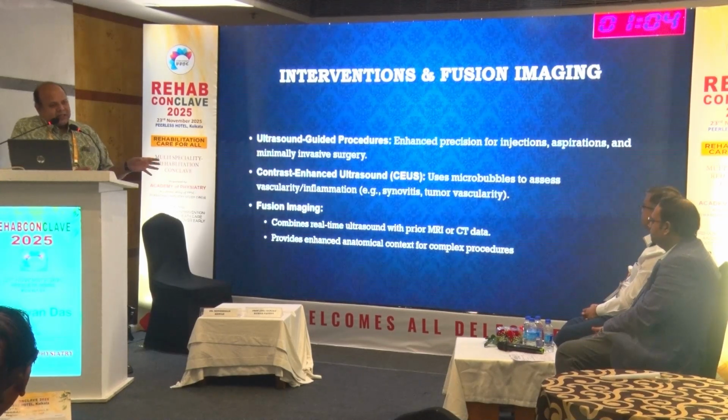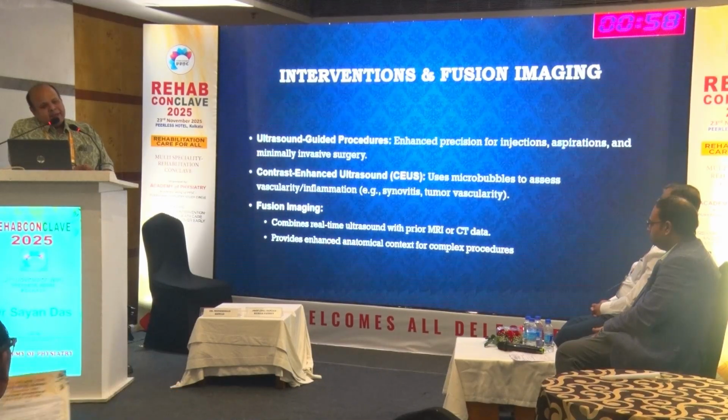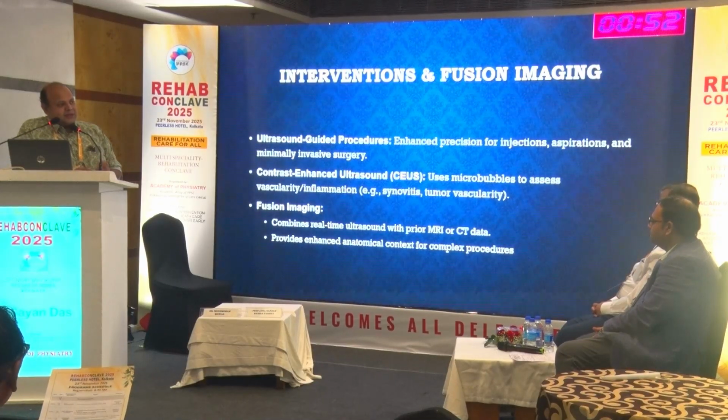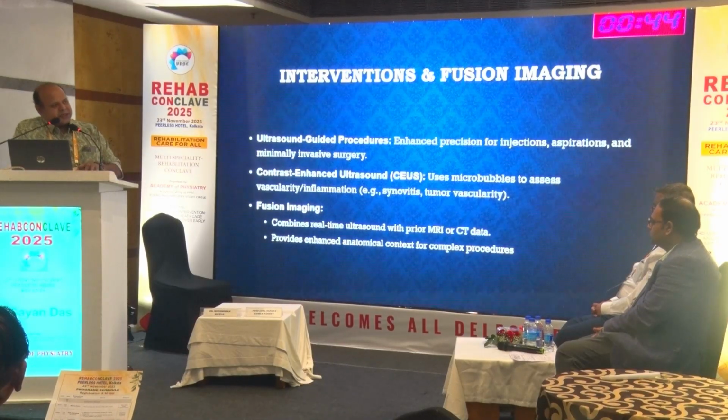There is a stationary table which is calibrated the same as your MRI or CT table. Now there is 3-point immobilization. That means 3 anatomical structures which you first have to identify on your probe. That actually calibrates the patient with the machine and the images.